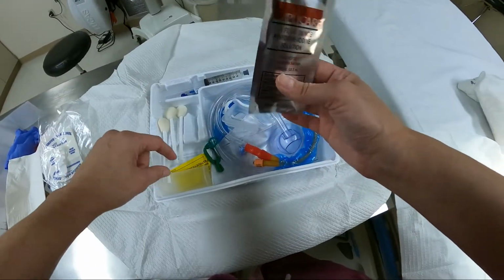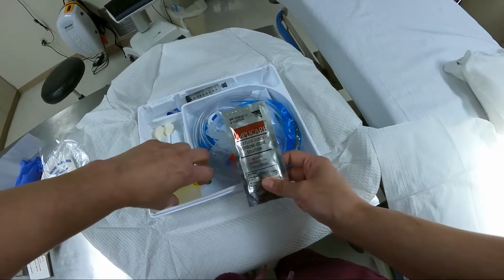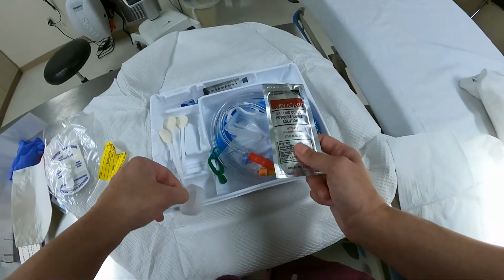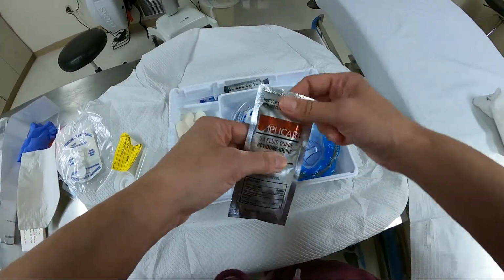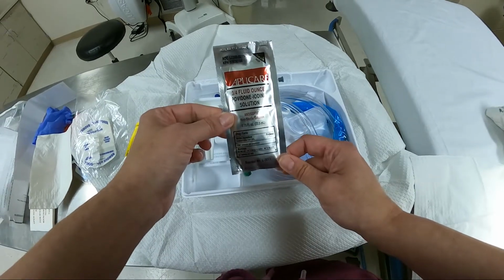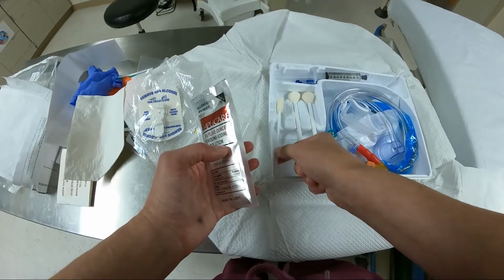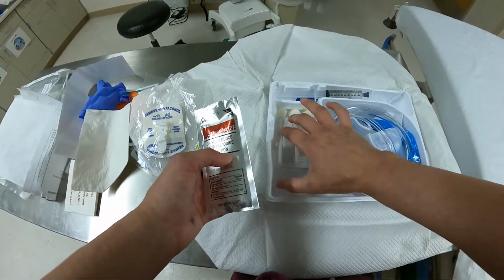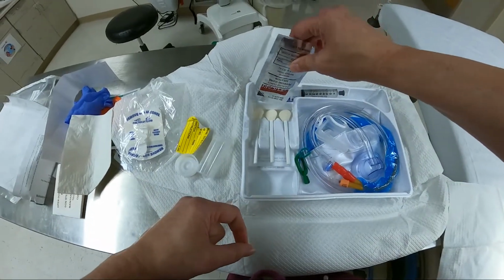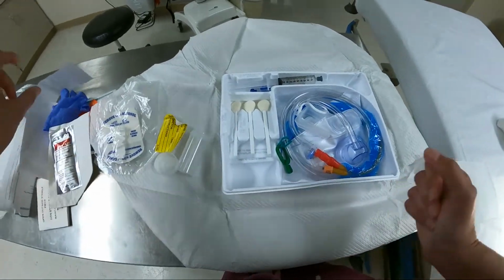You need to make sure that the patient is not allergic to iodine because you're going to be cleaning them with that. Seeing that it is winter and this just came out of a car, it's the first time I've seen solid iodine solution. So we're not opening that, but these are set in there like this. You may have to redo that. Open it up, pour it in there so that all the tips are in the solution. Then you put that to the side.